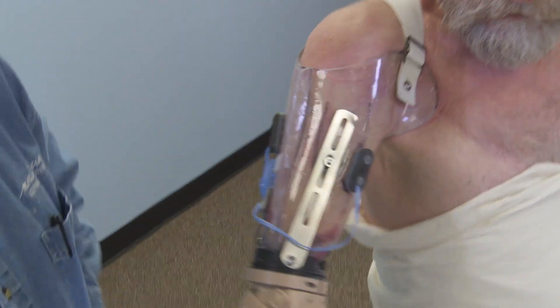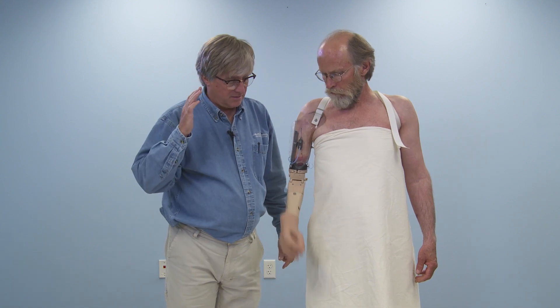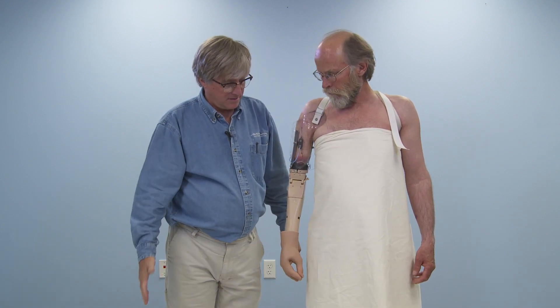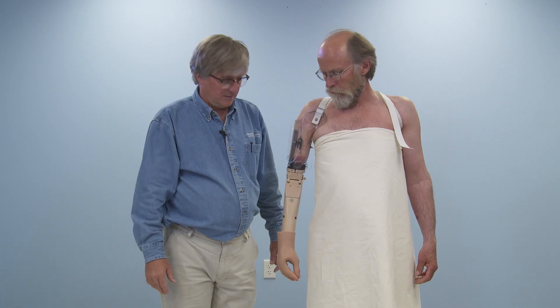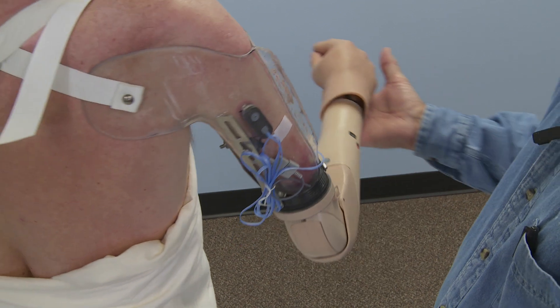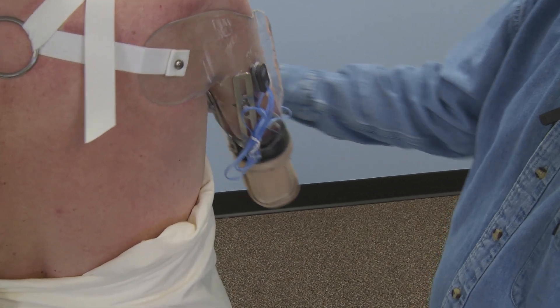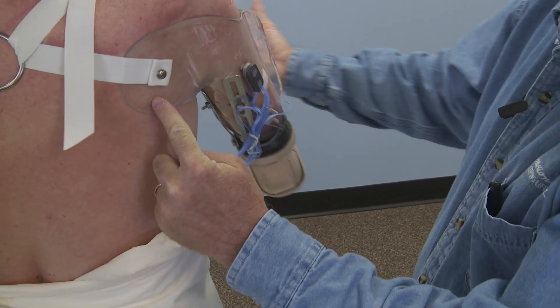You are now ready for the patient to operate the prosthesis. Notice how the socket design provides translation of motion in abduction and adduction, flexion, extension, and especially rotational forces. Many times, individuals move objects toward the midline. The posterior wing provides stability for these rotational forces.